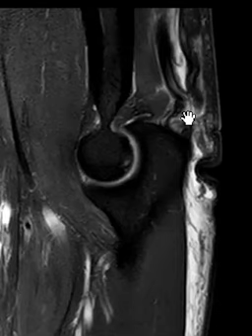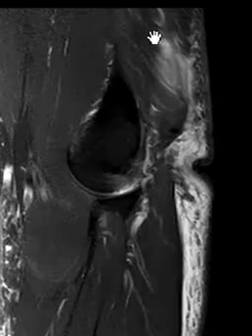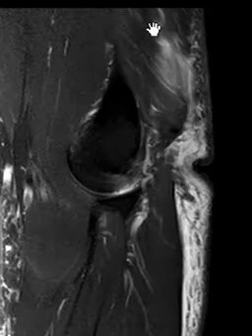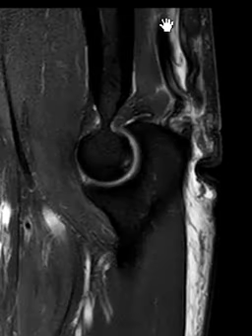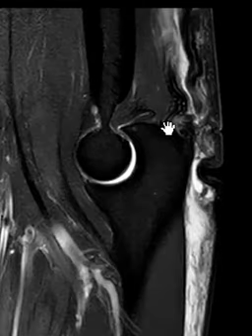Now there's another component about equal size here. This is the deep component from the medial head. And that has a tendon, and there's also some muscle fibers from the medial head here if we go across. So this is the medial head muscle. This patient has a partial tear in the medial head muscle, this bright spot here. And the medial head muscle comes down, gives off a central tendon here, and also some muscle components that come down here to the olecranon.